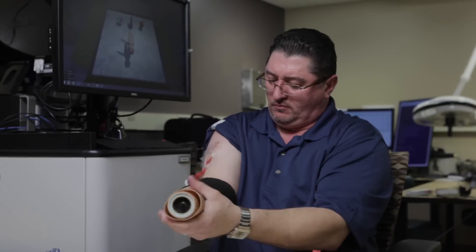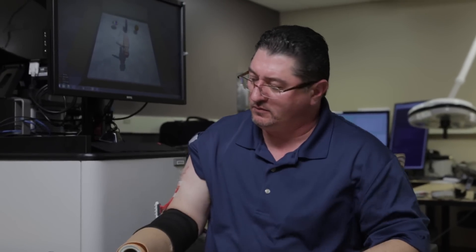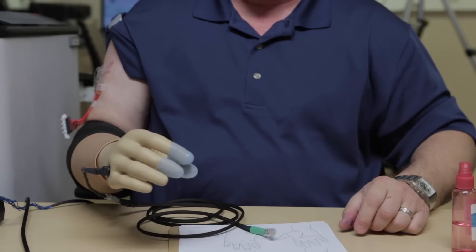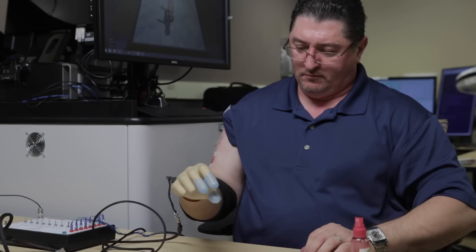Prosthetic limbs have spent a lot of time in development — the mechanics, the electronics, the control systems, all the engineering pieces we can think of. The thing that's been lacking has been the sense of touch, actual feedback, a truly closed-loop feedback system. So what we have been able to add here is that feedback.